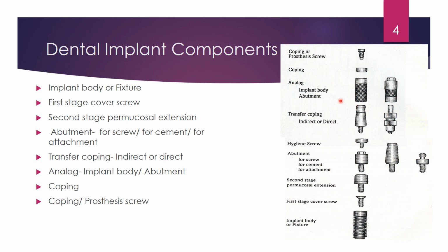It is used in the model to fabricate the prosthesis in the prosthetic lab. The abutment is fitted to the analog and the prosthesis is fabricated in the lab. So there is the abutment which will fit inside, and then it can help in forming the implant surface.